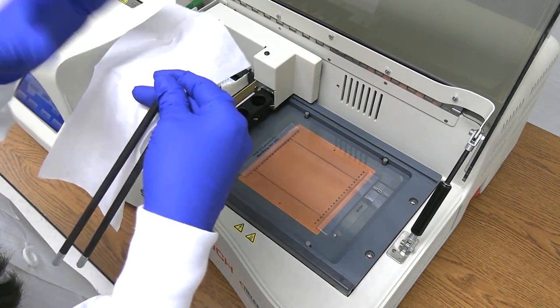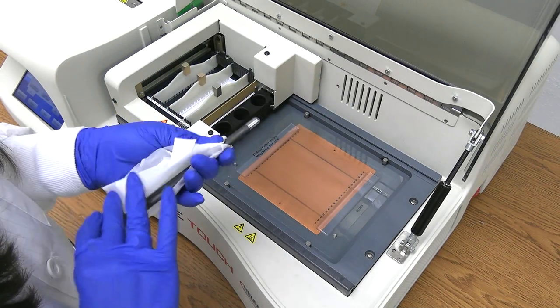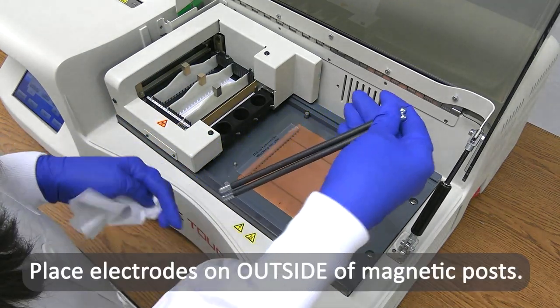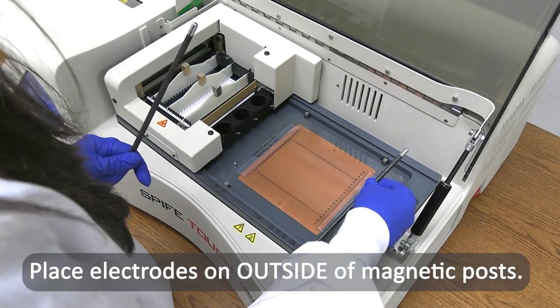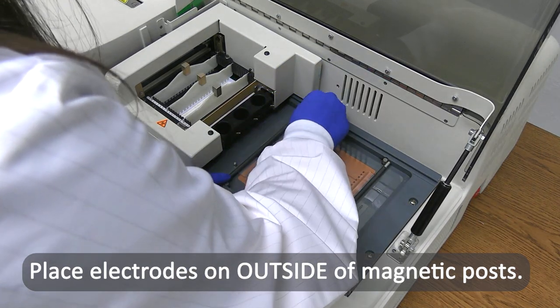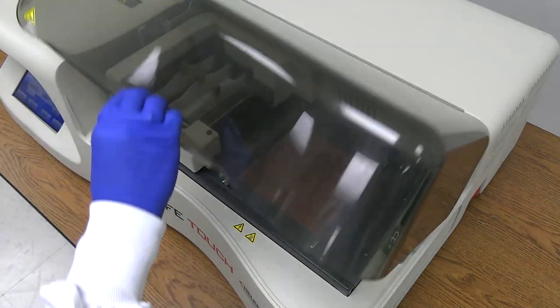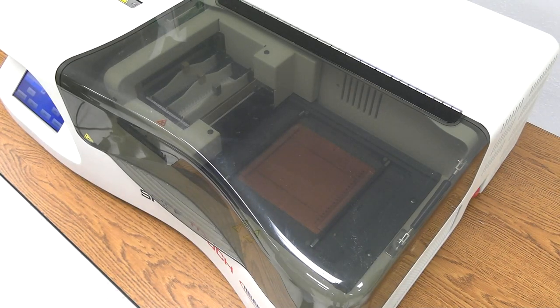Clean the electrodes with deionized water before and after each use. Then, wipe with a lint-free tissue. Place a carbon electrode on the outside ledge of each gel block outside the magnetic posts. Improper contact between the electrode and the gel block may cause skewed patterns. Close the chamber lid.